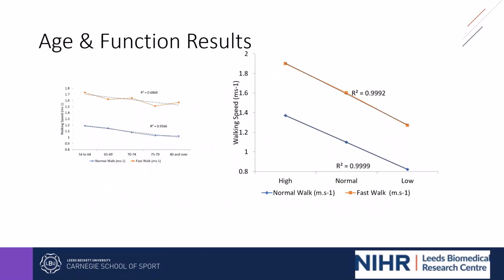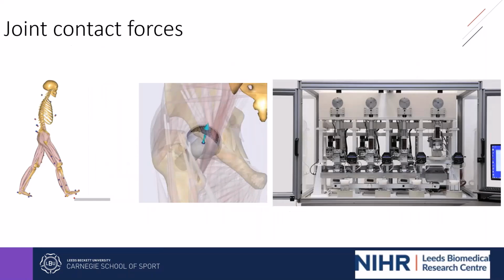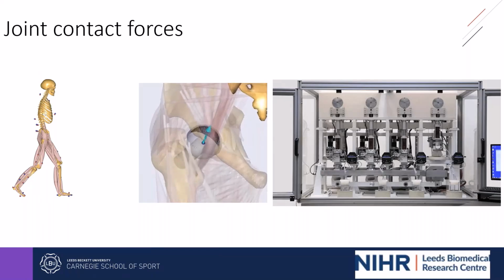So again, this was just very much based off the inverse dynamics, but the aim of our work package, just to revisit this, was to create some waveforms, and we can't do that just using joint moments and joint angles. So to do this, we needed to employ some musculoskeletal modeling. And like I've said, luckily for us, AnyBody Technology at the time were a partner in the project, which gave us great access to the support that they provide, which was a massive help. Alongside working with people like Enrico and Steve Voos at Zurich, we're able to generate these waveforms ready for a simulator to do some preclinical testing in vitro.